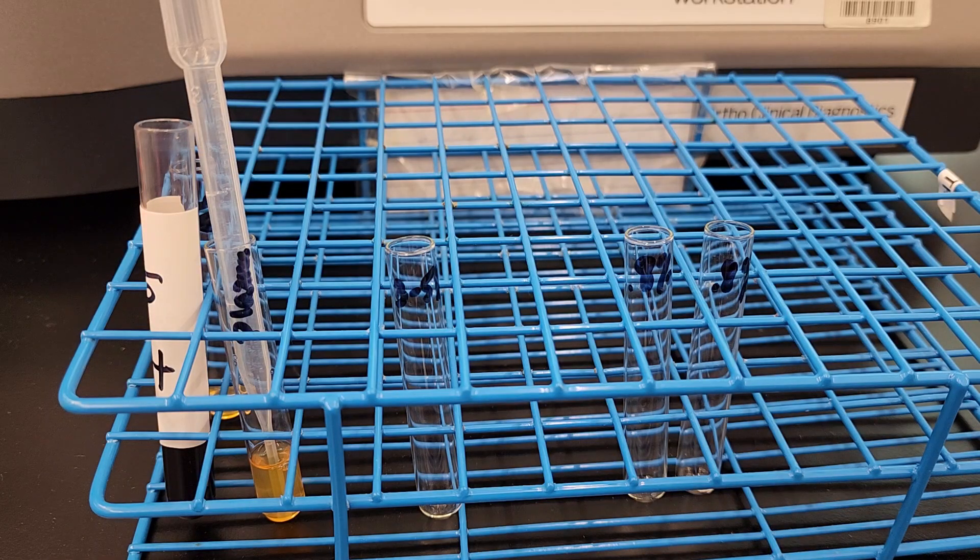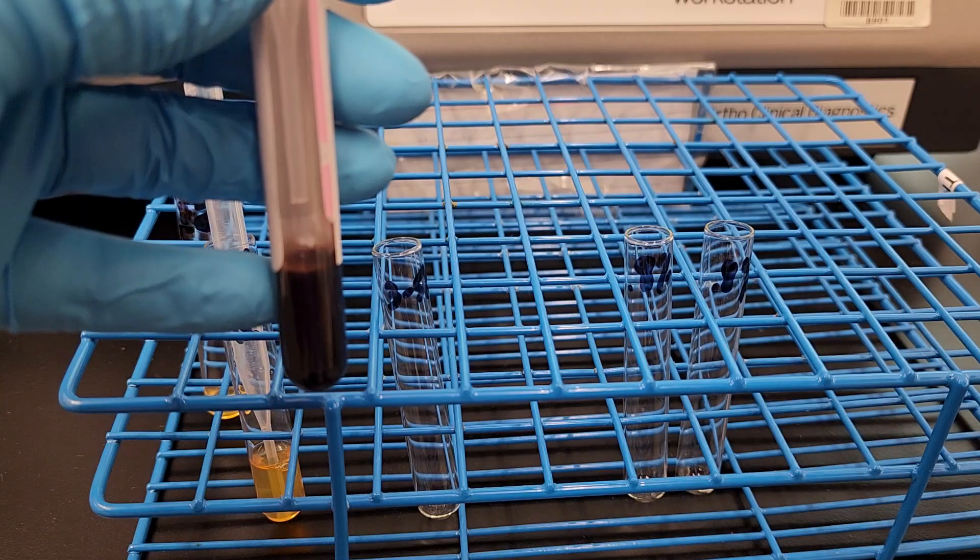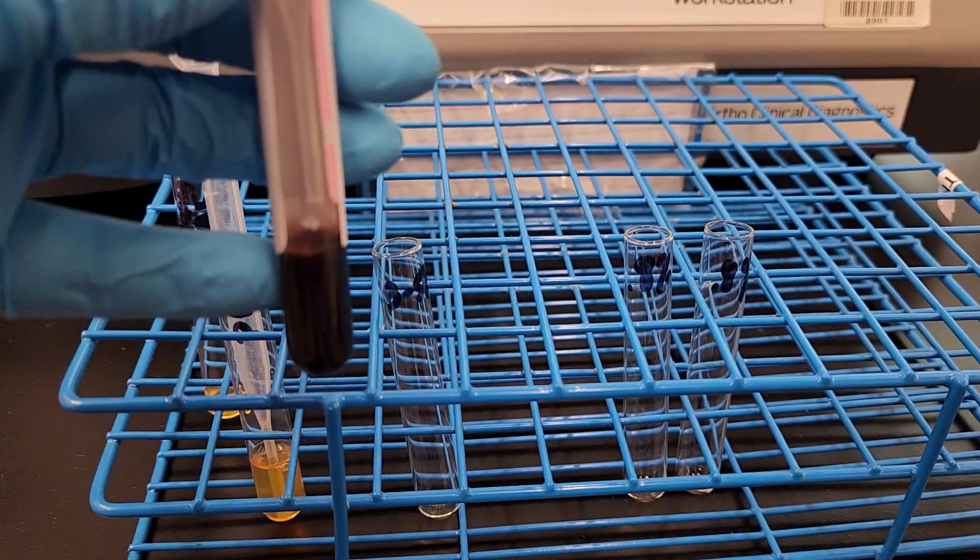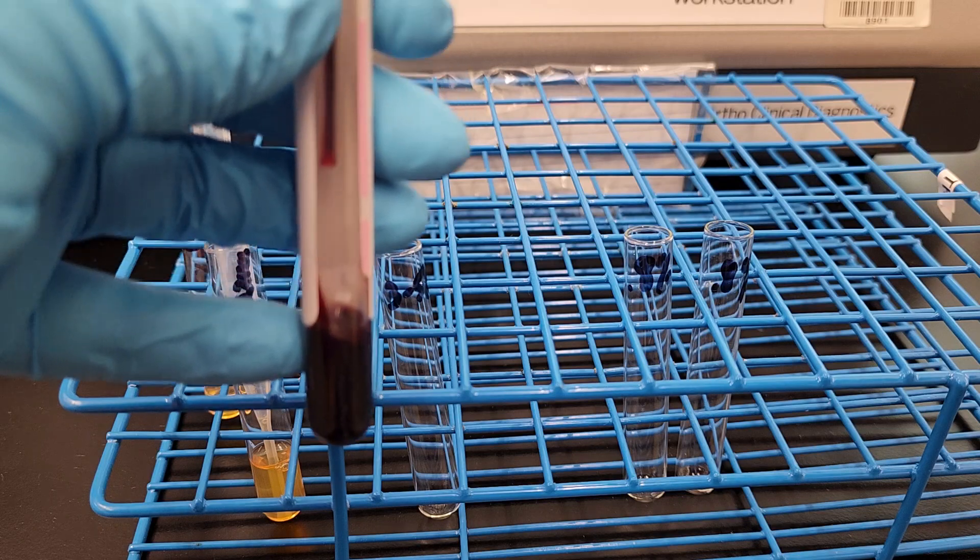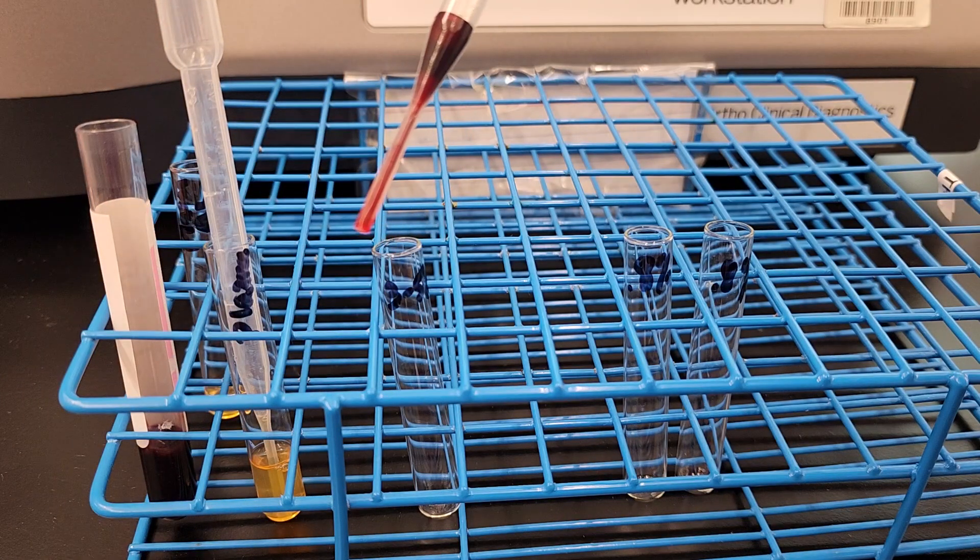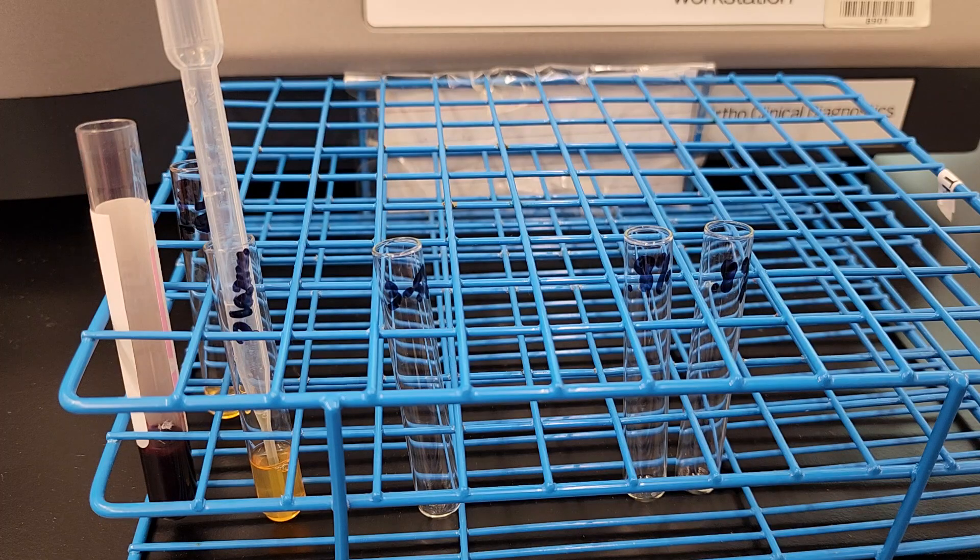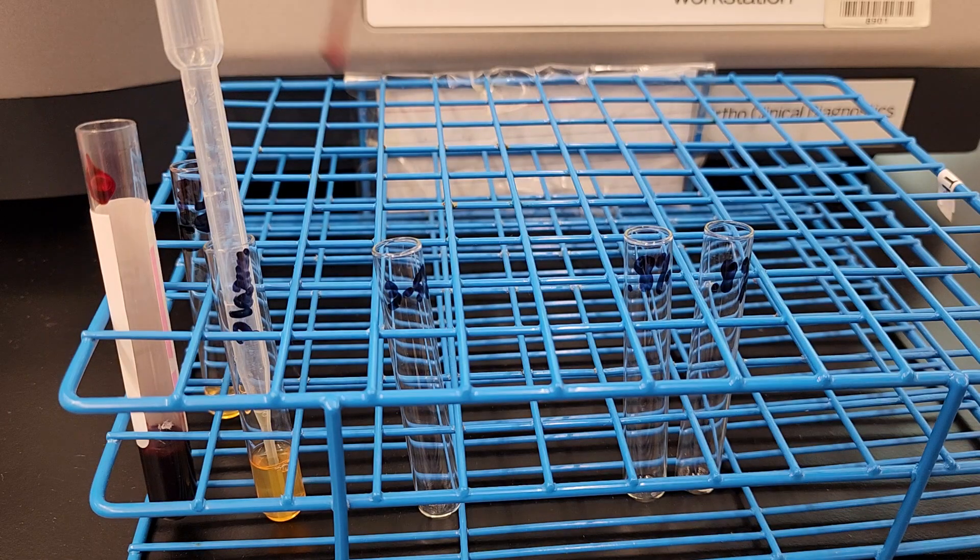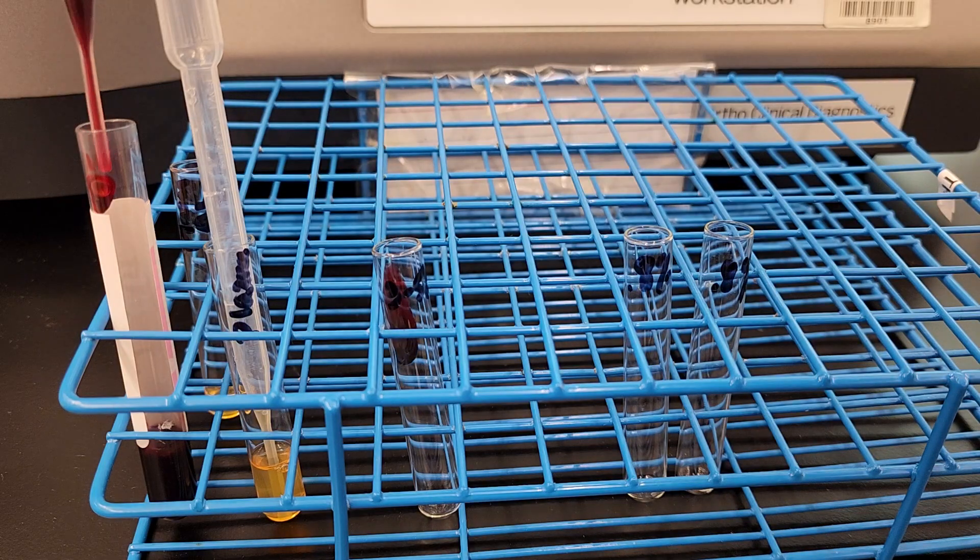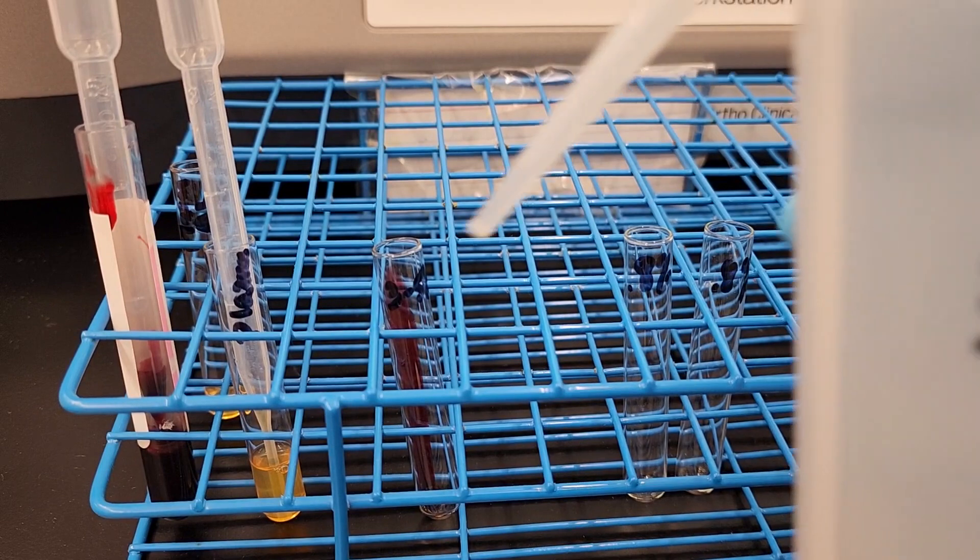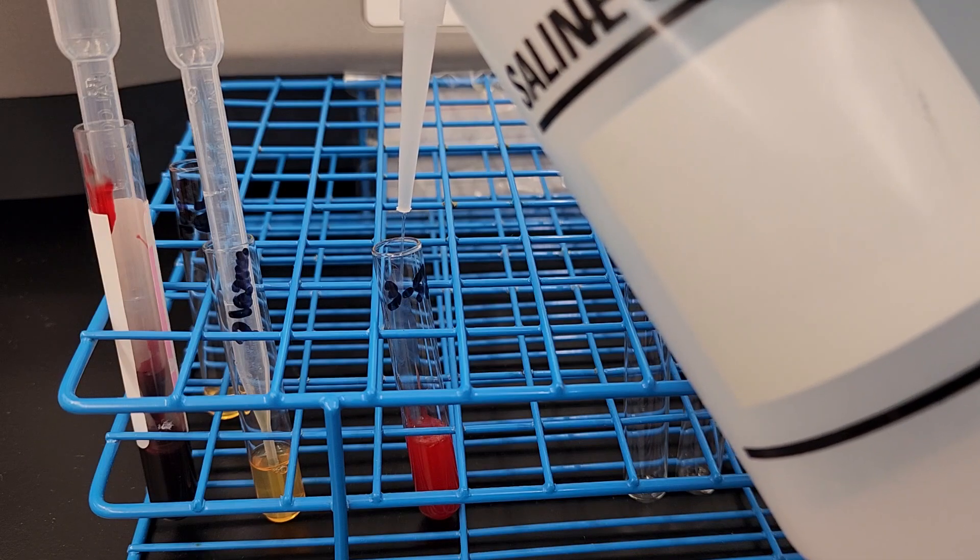All right, so now let's do our 3% to 5% cell suspension from my patient's packed red cells. So you squeeze the bulb. I'm squeezing the bulb. I'm putting it all the way down into the red cells and I'm pulling up packed red cells. I don't need to worry about the plasma because I already took it off and I had the bulb squeezed before I started. So I'm going to do 1 to 2 drops. That's going to be a bubble so I'll put that back in here. So I'm going to do 2 drops because usually we end up having to add more anyway. And then I'm going to add my saline.